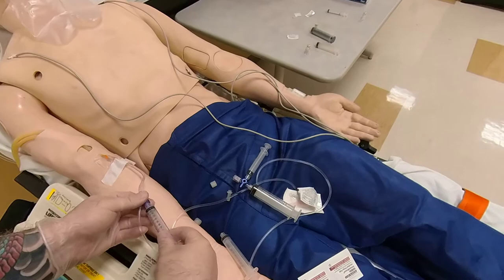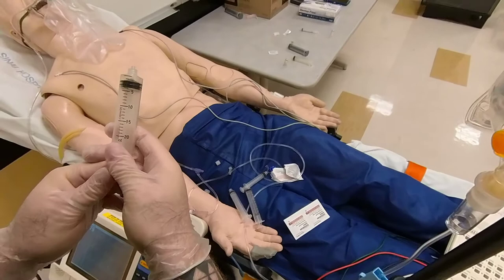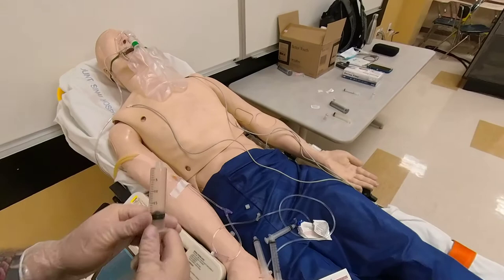The best technique to employ is the single syringe method: take a 20 cc syringe, draw up 2 mL or 6 milligrams of adenosine, and fill the remainder with saline. Make sure there are no air bubbles — you don't want to give the patient an air embolus. Whether you have a saline lock or running IV fluids, occlude the access port, connect the syringe, and look at the monitor when you administer the medication. This is the best way to do it.